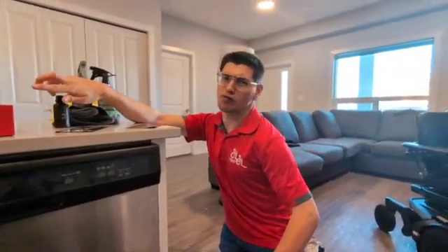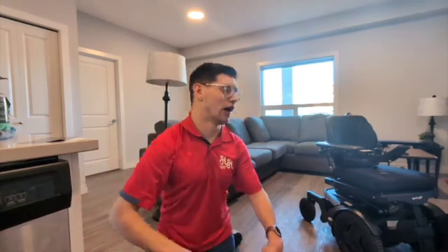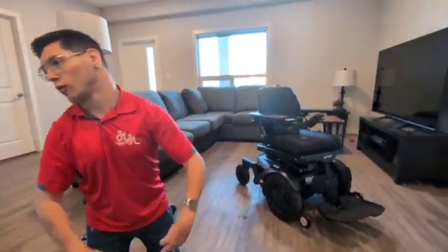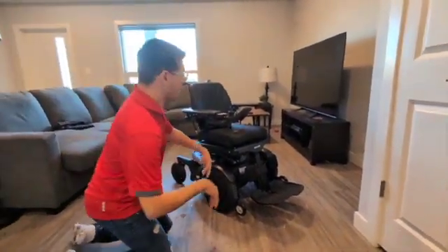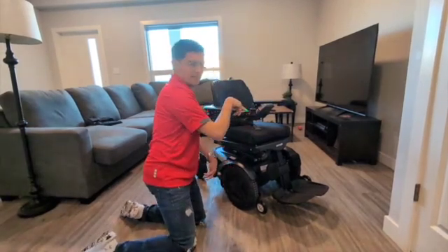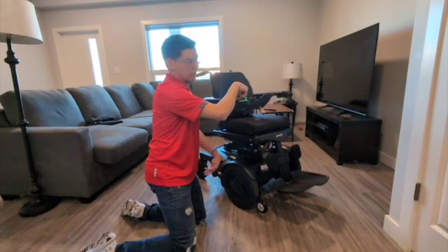Normally I would do Opti Coat slammer coating. That's what I have on my other wheelchair, but it's nice to change it up once in a while. So, to make it easier, I'm going to turn the chair on and elevate it all the way up so I have way more room to work.